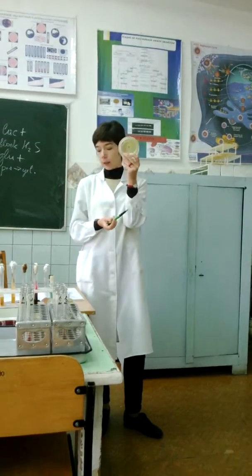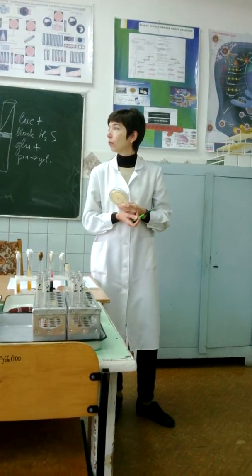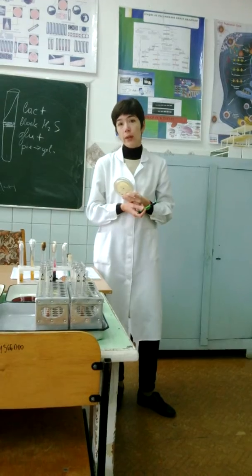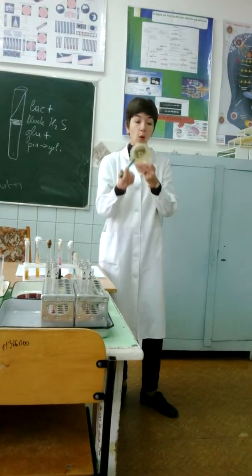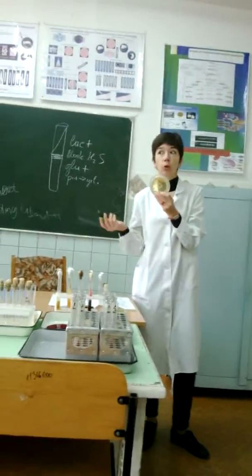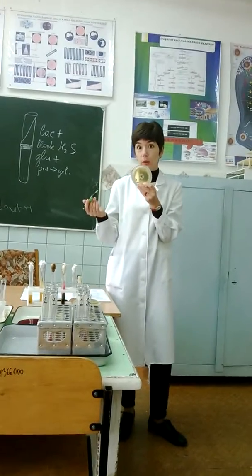Then, this test, the Elek gel precipitation test, is used for identification of toxigenic strains of Corynebacterium diphtheriae. It's not for identification of bacteria as suspicious. All these are species of Corynebacterium diphtheriae, but some of these produce toxins and cause the severe disease diphtheria. Some do not.